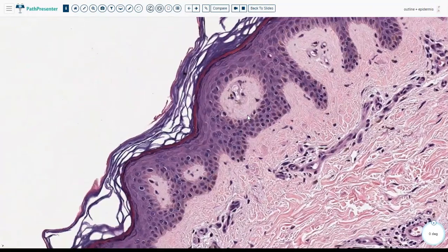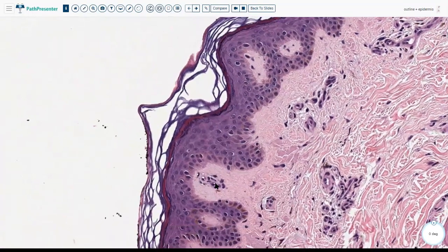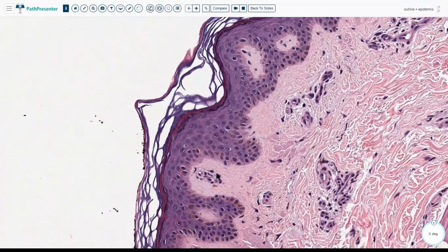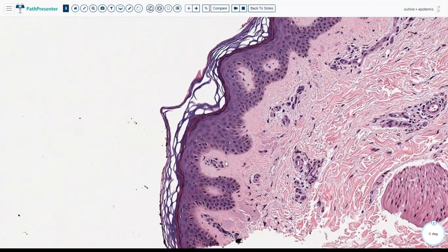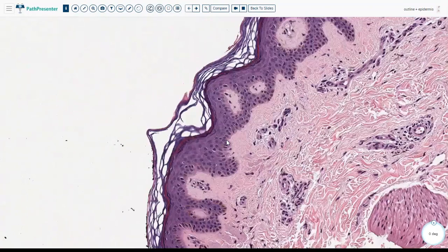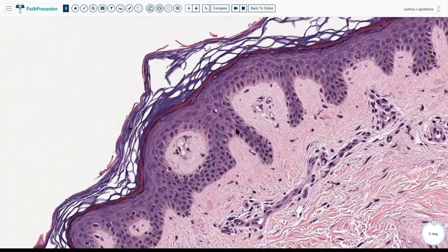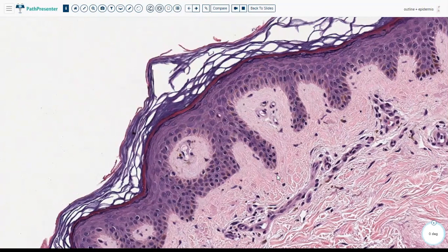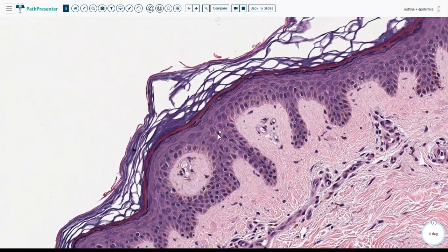There are several different cell types you would find in the epidermis. The most prevalent, of course, are the keratinocytes, which make up more than maybe 90% of the cells of the epidermis. However, there are several other cell types in the epidermis. One of them is what we see right here — if you can see how it's like a kidney bean-shaped cell — this is the Langerhans cell.